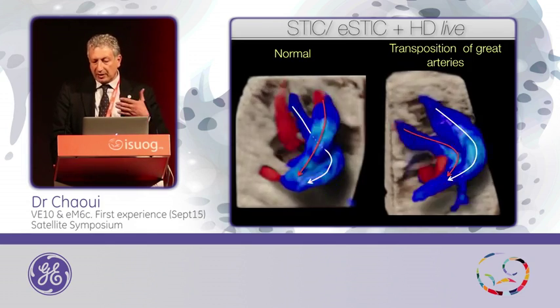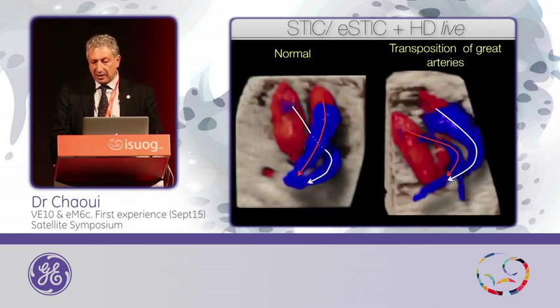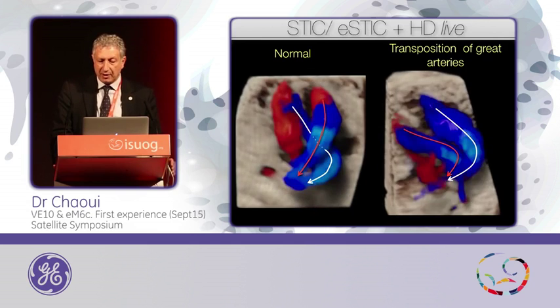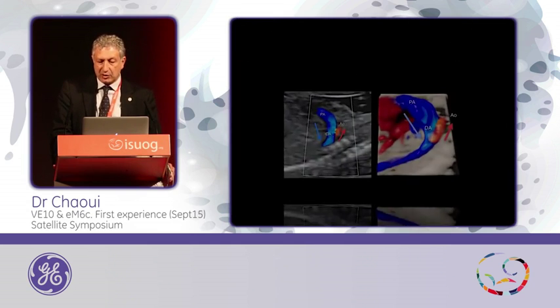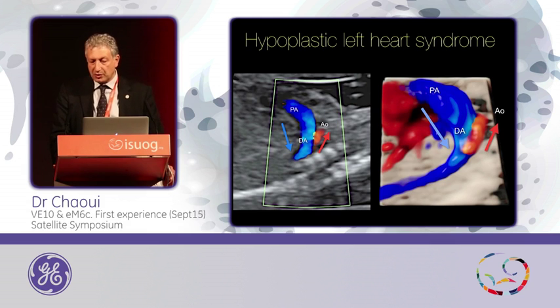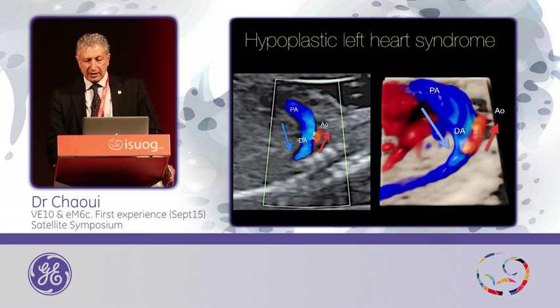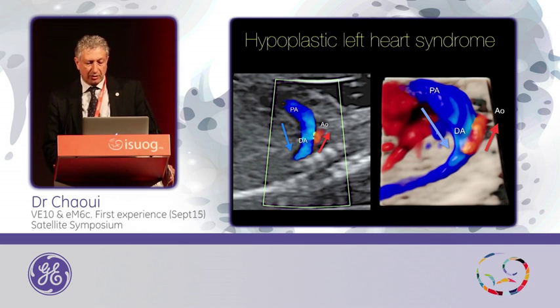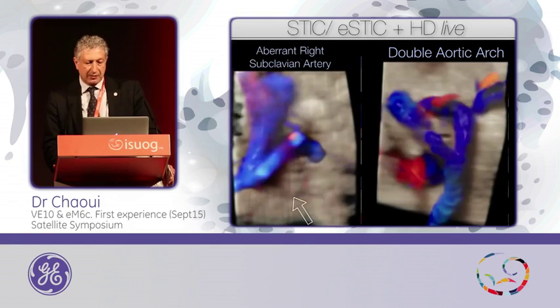With the effect of light, you can have a better impression of depth for these images. And this is another case with hypoplastic left heart syndrome, where you see the reversal flow in the aorta — not very well seen on a regular plane, but here with this technique it is clearly recognized.